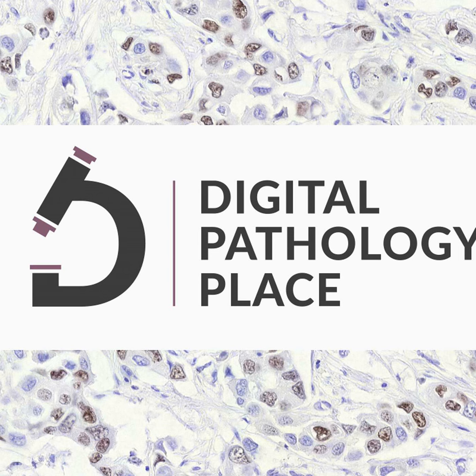But this is cultural. In Europe, it's mostly on premise on the IT facility of the hospital, of the university, of the research center, and so on. In North America, in America in general, in Asia, it's more asking to host it on Azure or AWS. But once again, as soon as it's server-side and web-based applications, the kind of hosting solution doesn't really matter.